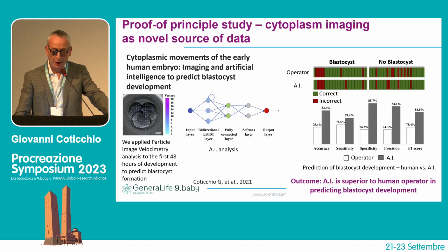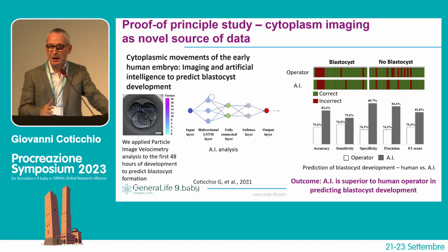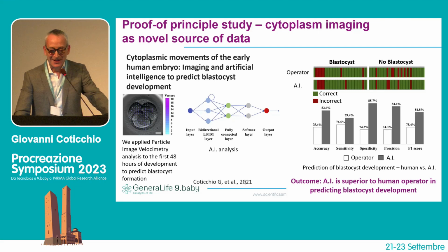And although the study is pilot in nature and requires further expansion, we found that this entirely new approach was able to predict blastocysts better than an experienced embryologist in terms of accuracy, sensitivity, and all the parameters you can appreciate in the slide. So there are different ways to skin a cat, if I'm allowed to say that.